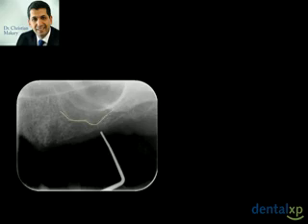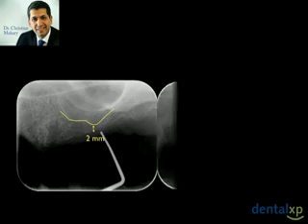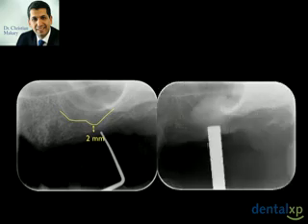Here, this is the sinus, and residual bone height was 2 millimeters. And also, with the use of an osteotome that went through this 2 millimeter residual bone height, we went from this small amount until we reached a very nice new amount of bone into the sinus.